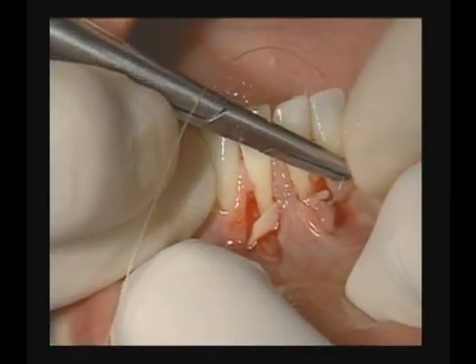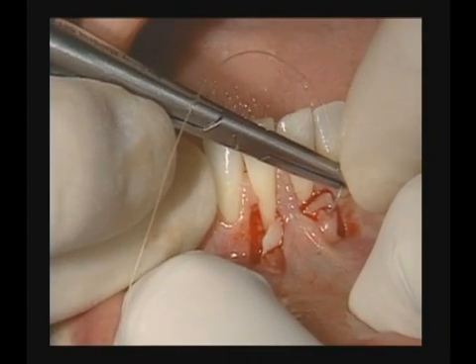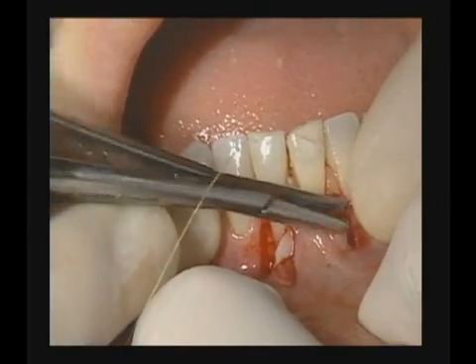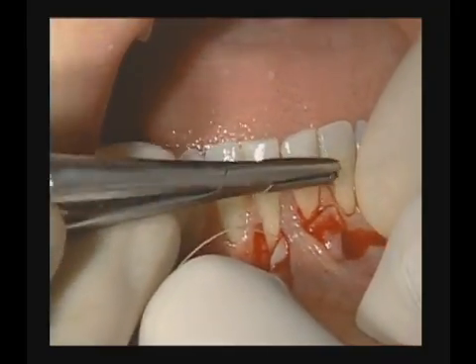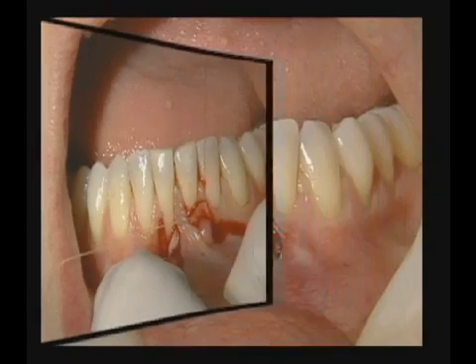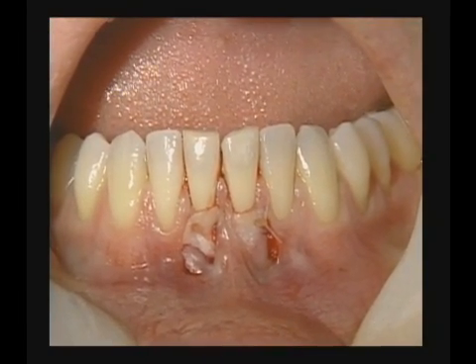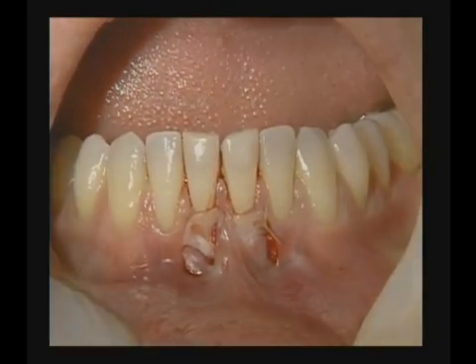So we'll catch the graft on one proximal border and actually penetrate through the papilla for security. Now we see the graft following positioning of the graft beneath the midline papilla with two sling sutures, one around each center.